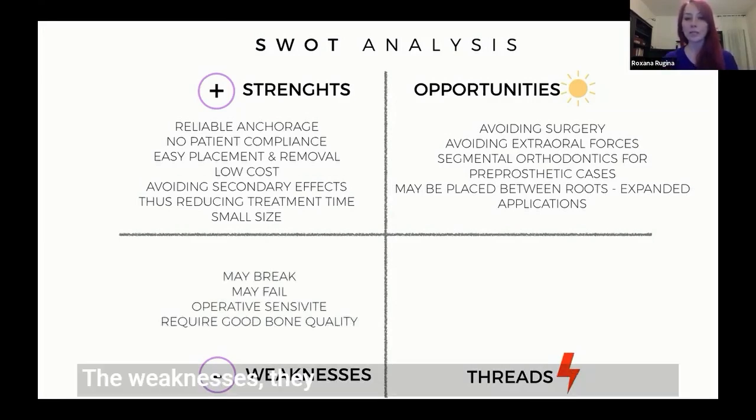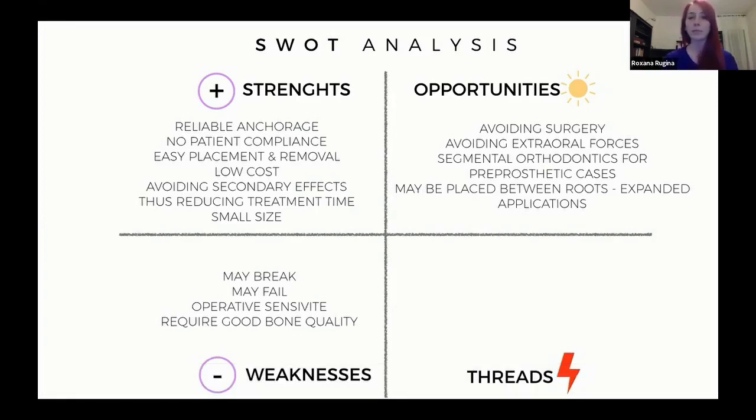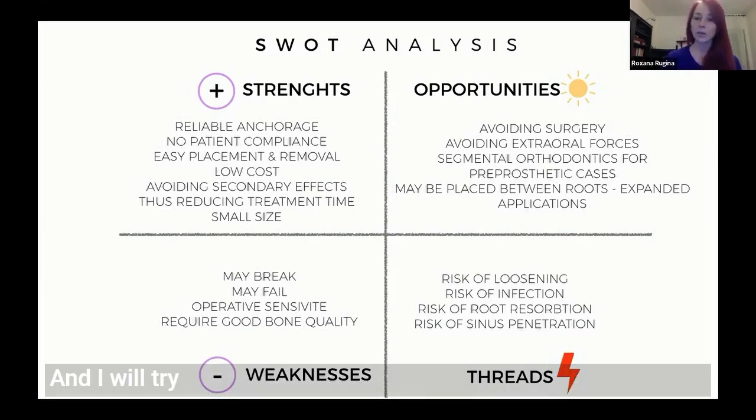The weaknesses: they may break or fail, and they are operator sensitive, which means the more we use them, the more experienced we get, and the easier it will be for us to use them. And we need good bone quality to place them. And the threats: there's a risk of loosening, infection, root resorption, and sinus penetration. And I will try to cover some of these topics in my presentation.